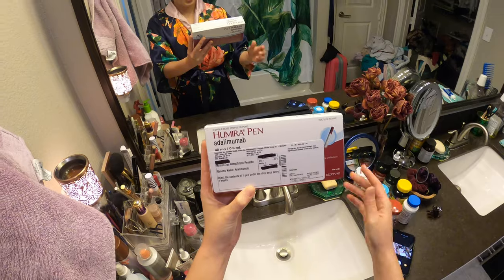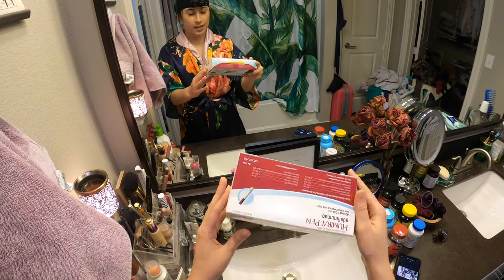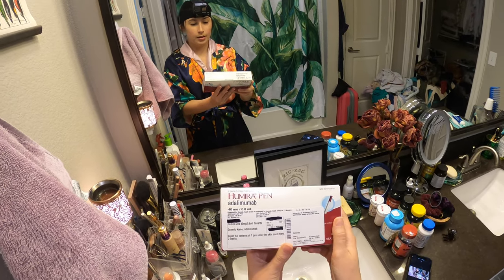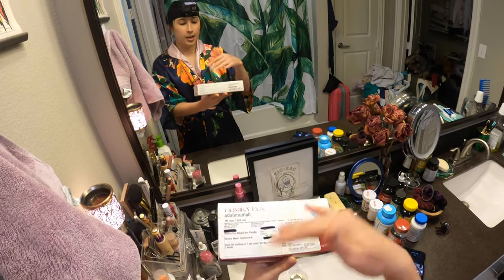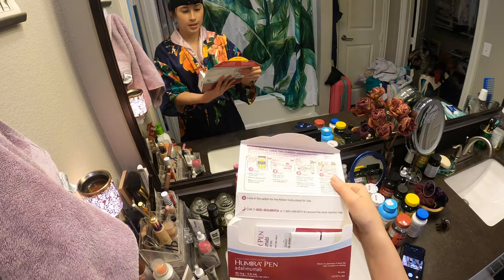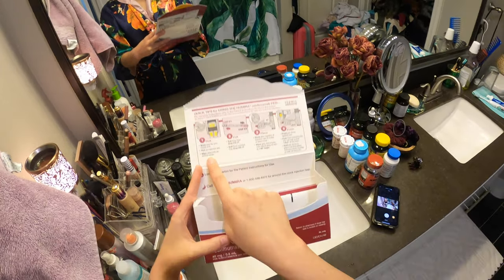So this is the kit — not the starter pack. This is a month's supply. It comes every month and it comes in a cooler from my pharmacy with some ice packs.